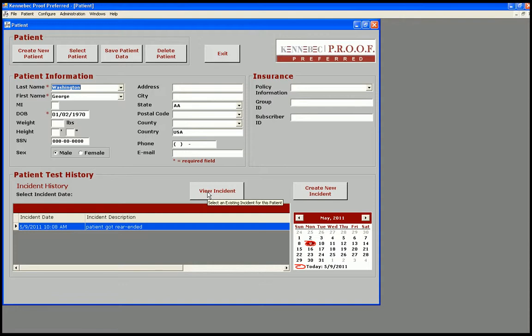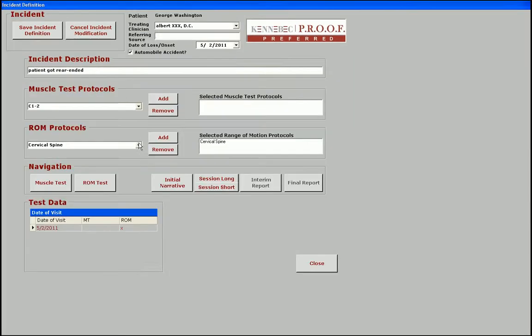Let's pull up a patient record and then pull up the incident we previously created. On the incident screen, we can describe the details of the incident and assign a treating clinician to the patient's case. We can also assign existing protocols for range of motion and or muscular weakness.